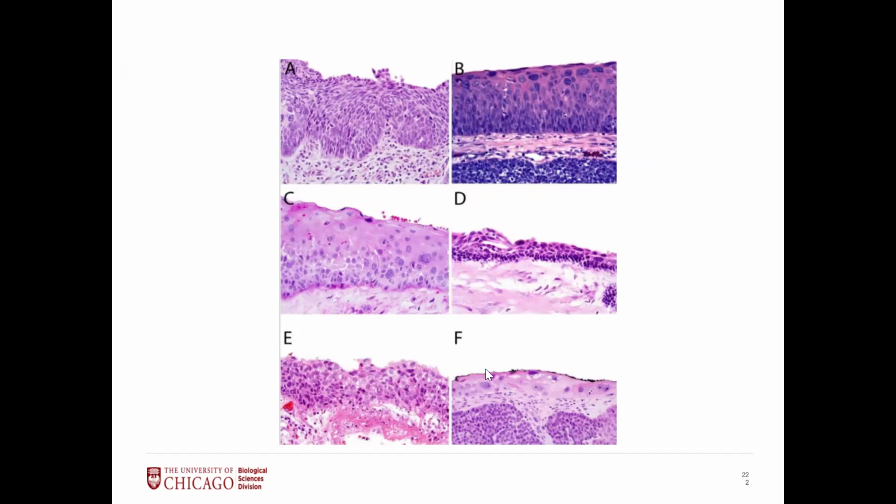And if you do HPV ISH, all of this is going to pick up. The overlying epithelium is going to be positive for the ISH, and the infiltrating tumor is going to be positive for HPV ISH. Your ISH has to include HPV-33. This is most commonly HPV-33. So if your high-risk ISH only has 16 and 18, and some institutions only have those two, you're not going to pick this up. So you need to have the full spectrum inside of the organization to really prove this.